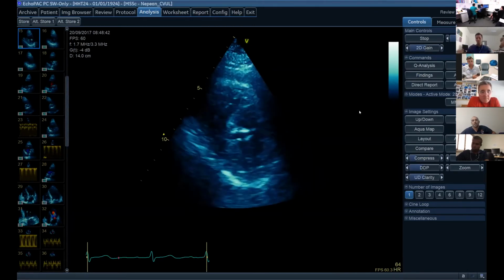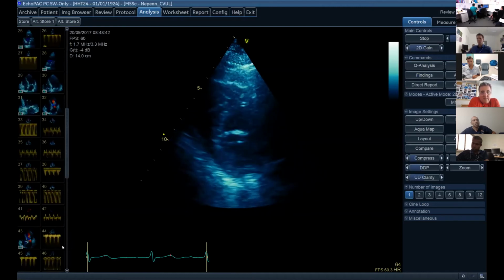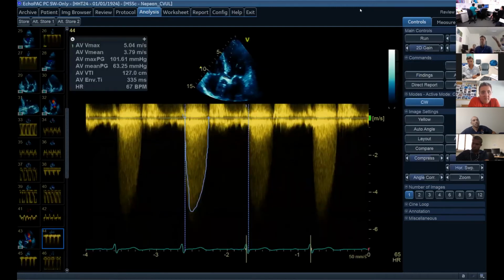Can you please open that same image again, the gradient one, the aortic valve? Just one point. I think the Doppler angle is also not very correct, because it looks like there's a sigmoid septum, which I think we need to take into account before calculating.